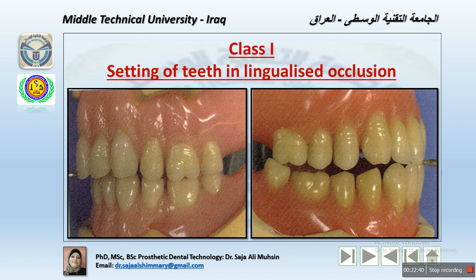To aid the stability of the denture during protrusive movement, for example, a reverse first premolar, which is called the spare premolar, can be placed behind the last lower molar, as in the image on the left side. This acts as a locking device during mastication, along the compensating curve, to avoid the upper arch from sliding downward and the lower arch from protruding anteriorly and falling as well.